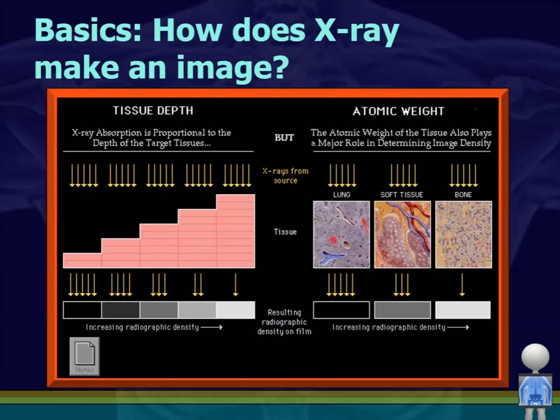Just before we start talking about x-ray, let's talk about imaging and what is x-ray, regardless of chest x-ray. Remember, x-ray is all about density. X-ray is all about density. That's how it's making the picture. It's really important to understand that when you try to decide what should I order today, you need to know why you're doing it, how you're doing it, and how the picture's made.